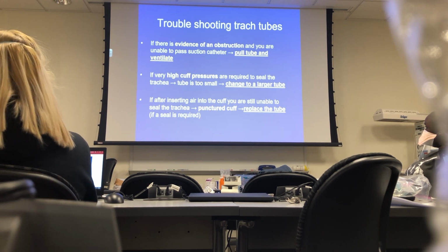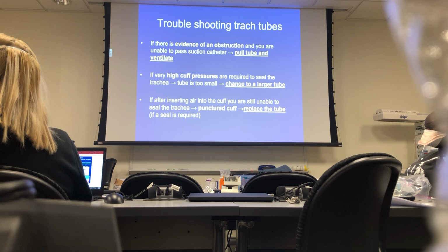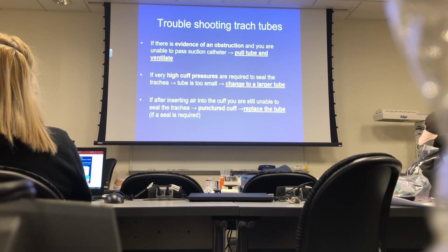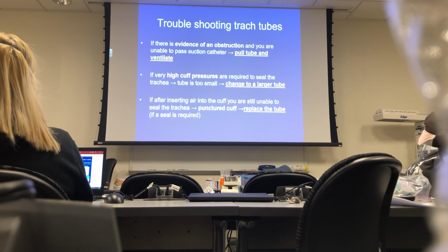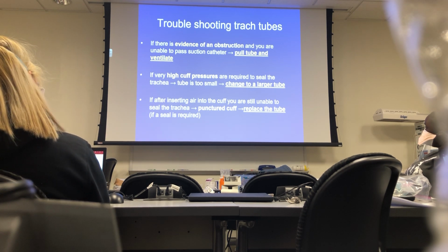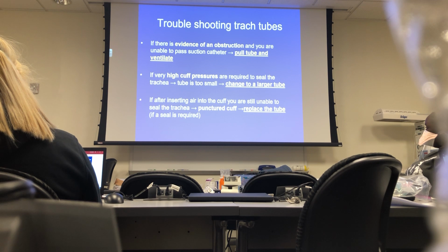Okay, so the boards also like to say, what would you do if you found out the patient had an obstructed trach? Well, on the boards, there's no doctor. You're the doctor. What do you do? You take out the trach, okay? If you can't pass a suction catheter, you take out the trach tube and then manually ventilate nose-mouth. If you have super high cuff pressures, the reason is usually the trach tube is too small. You replace the trach with a larger tube. Okay, if you're inserting air into the pilot balloon and nothing is happening, and you're still leaking, you have a ruptured cuff. You take out the trach and replace it with a new one.